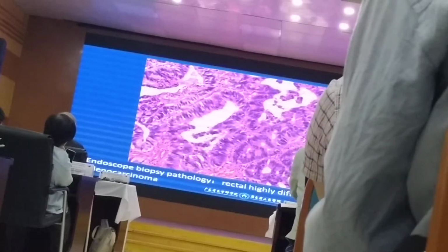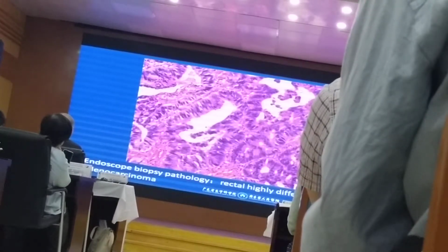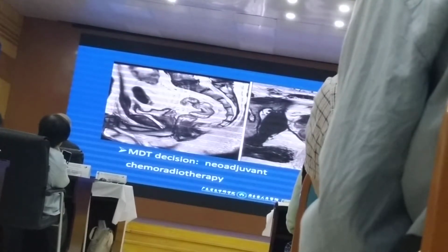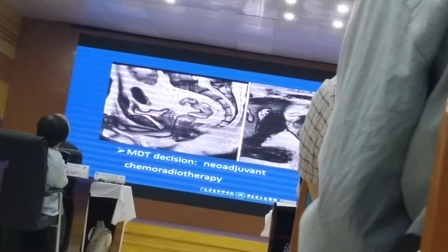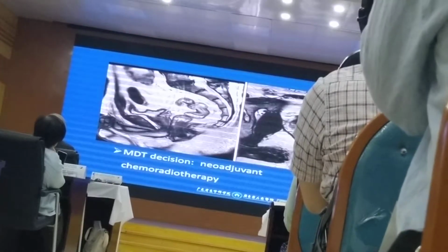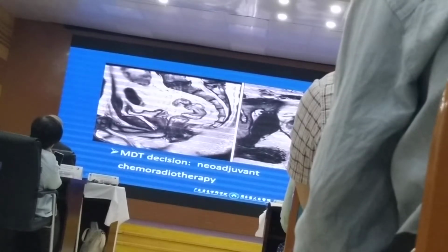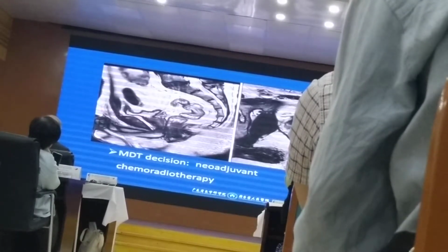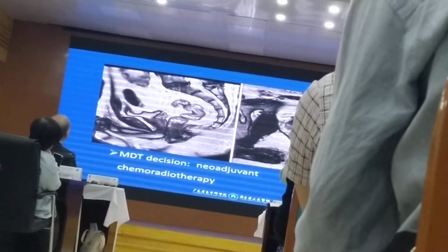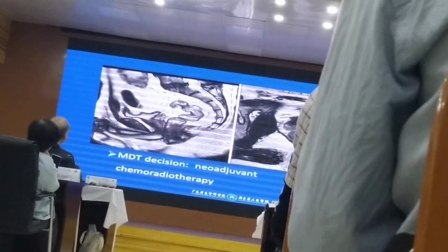Based on the findings of the endoscopic biopsy, highly differentiated adenocarcinoma of the rectum was found. Since the lesion was located very low, and the patient required the anus to be retained, the physician decided to perform neoadjuvant chemoradiotherapy before the surgery after the MDT discussion.